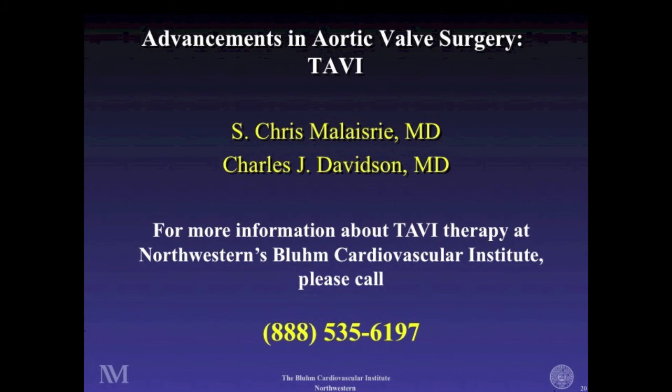Yeah, I'm reading it as best as I can. I think her interest is as to whether or not you and Dr. Davidson may enter into an operation in which TAVI is the objective, but something occurs during the procedure and it ends up converting into an open heart procedure instead. I think that's what she's going after. You know, I would add on to what Chris said, and I think it was a perfect answer, that with all cardiac procedures, we always have a multidisciplinary team available.